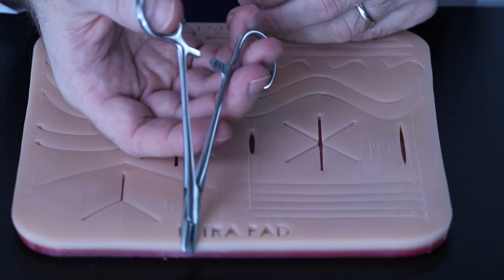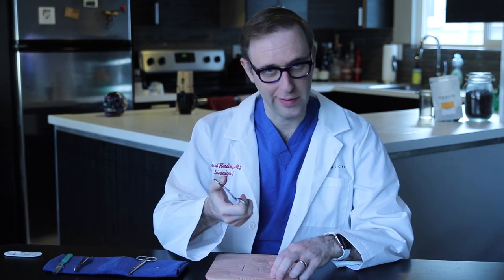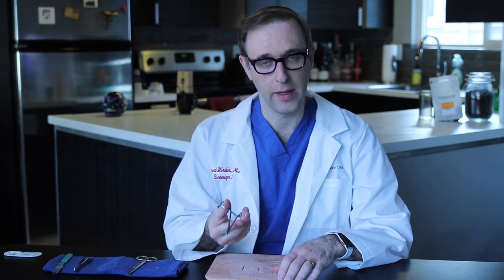The first thing we're going to need is our instruments. What I have here is a needle driver. The proper way to hold the needle driver is with the tip of the thumb just partway into that loop, and then the tip of your fourth finger into the other loop. You don't want to hold it like a pair of scissors. By holding it gently in your thumb and fourth finger, you have enough control, but it's loose enough that it's easy to maneuver and let go when you need to. In the back here, you see these locking teeth that let you lock onto something like the needle and hold it in place. This is your needle driver.